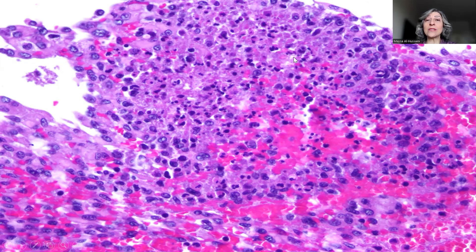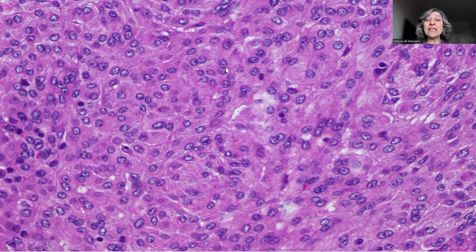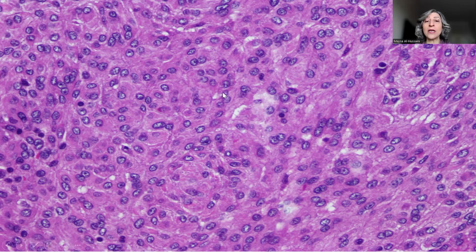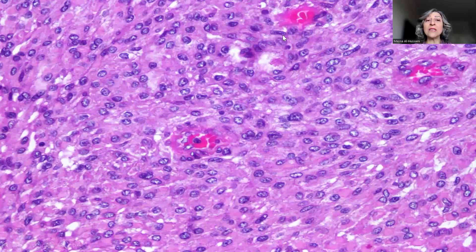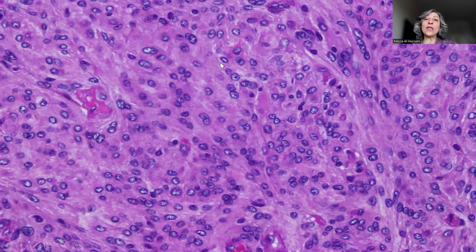Thus, this necrosis is considered to be spontaneous. When we go from one area in the tumor to the other, it all shows a similar morphology with a sheet growth pattern, rather than the usual meningiotheliomatous or fibrous or any special type of meningioma. This sheeting growth pattern in the absence of any identifiable, well-discerned pattern of growth is another feature we evaluate whenever we encounter meningioma, to determine whether it is typical or atypical.